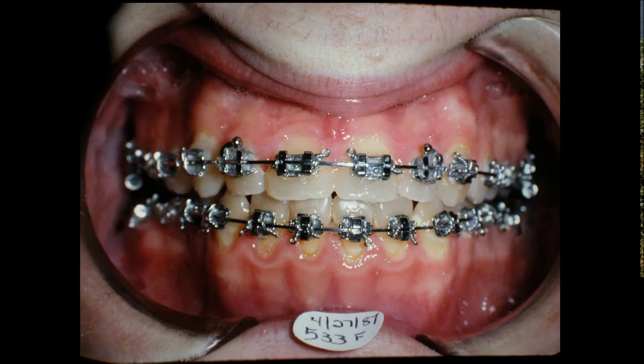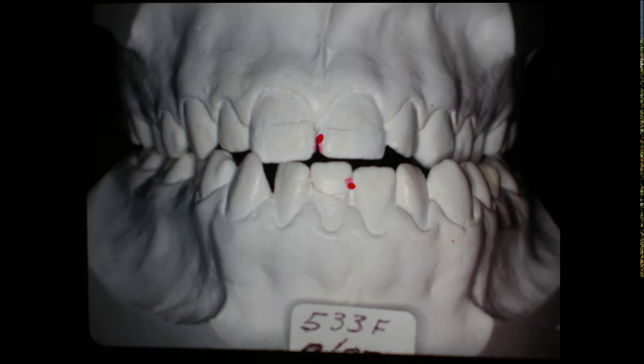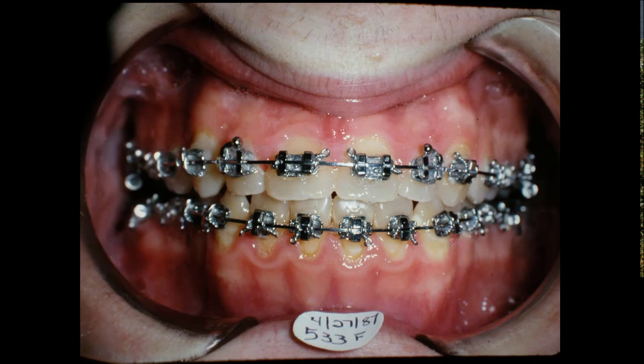Now in the front, you see where the surgery corrected the midline. It looks perfectly fine now. So he's shifted the jaw around in the surgery, and of course corrected this. We got the two arches kind of coordinated, though they didn't fit. And then he moved the jaw around like that. There's the way the jaw was. There it is now.